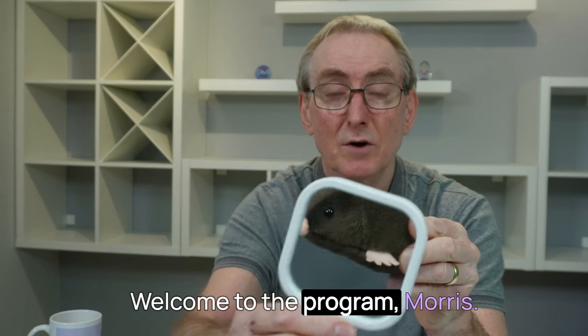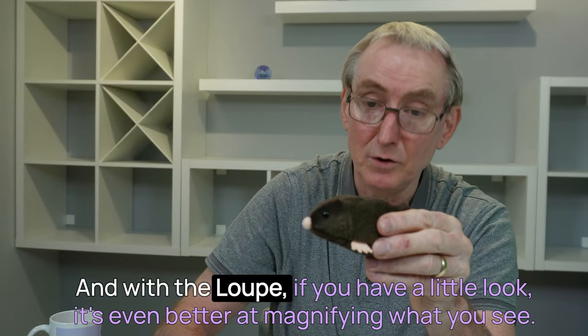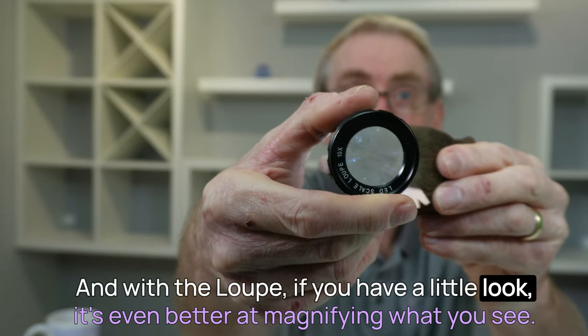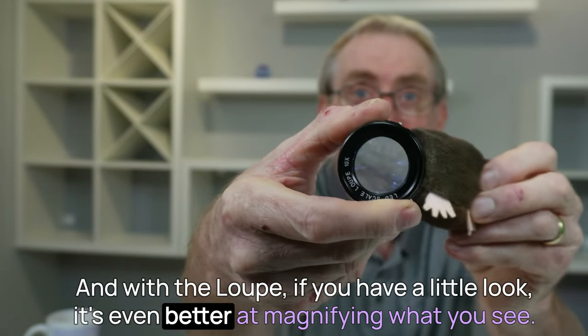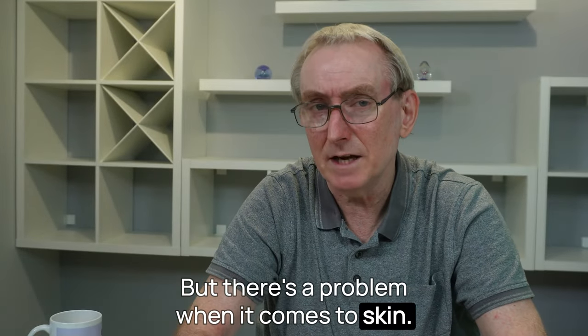Let's try them out on a mole. Here's our mole — this is Maurice. Welcome to the program, Maurice. And as you can see, the lens isn't too bad. And with the loupe, if you have a little look, it's even better at magnifying what you see.